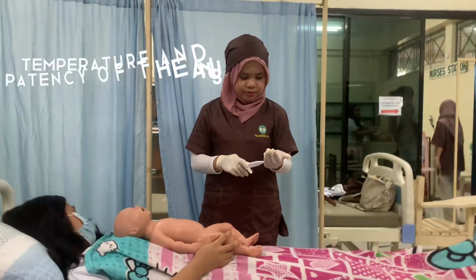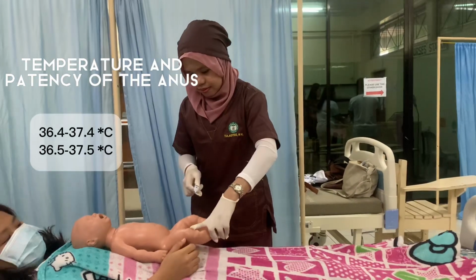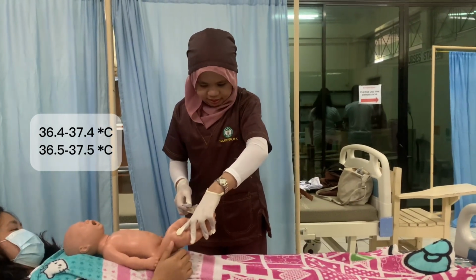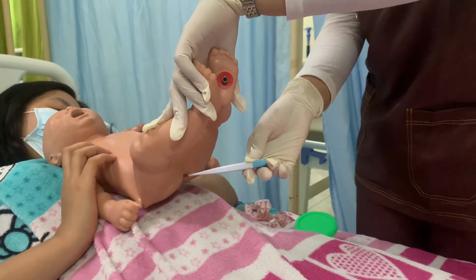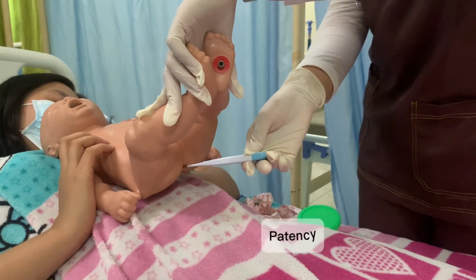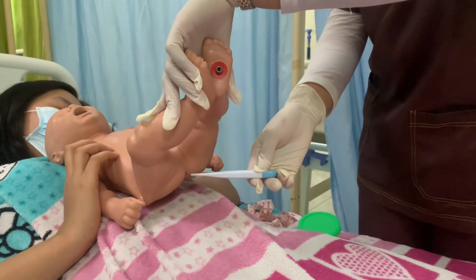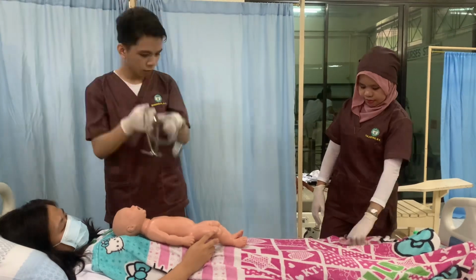For the temperature, the normal temperature range for an infant or newborn is 36.4 to 37.4 degrees Celsius, but in other sources it is said to be 36.5 to 37.5 degrees Celsius. So the route taken is via the anal area or the anus of the infant. This is also for checking the patency of the anus of the newborn. Place the tip of the thermometer within the anal area or the anus of the newborn, and then wait for the thermometer to beep.